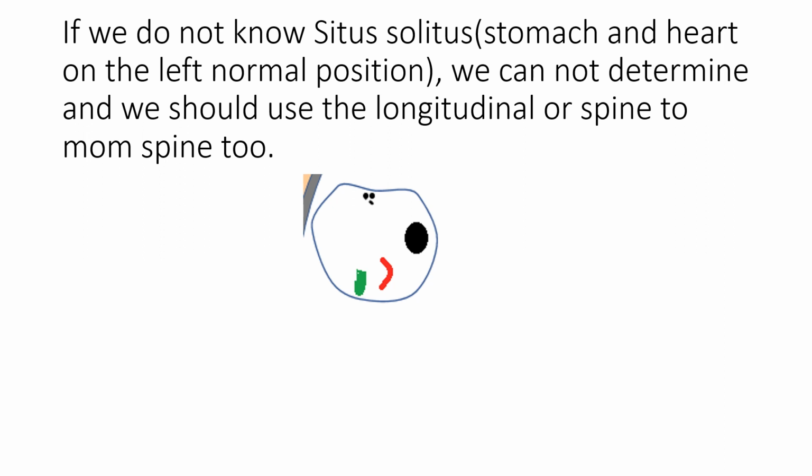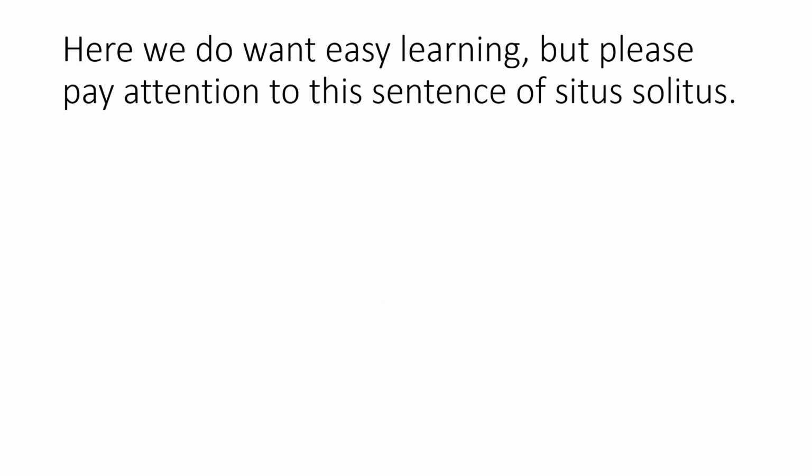The right side of the baby is anterior, near the transducer. So please pay attention to the situs solitus sentence. It is very important.